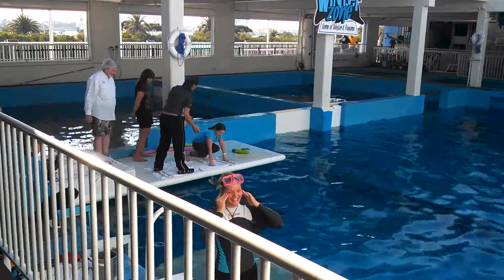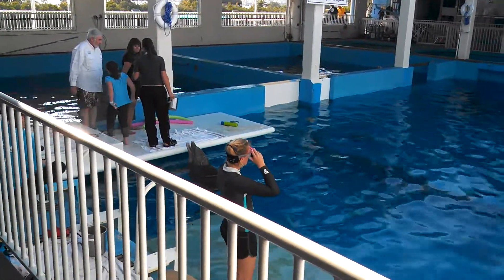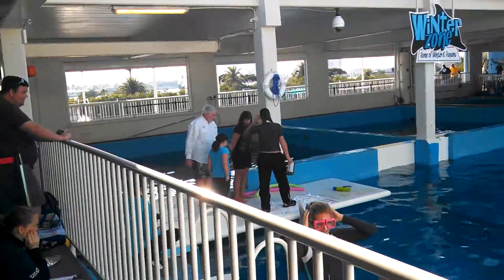We are teaching her to dive a little bit deeper with that prosthetic tail and not stay at the surface. That way it creates a little more resistance and she's using those muscles.